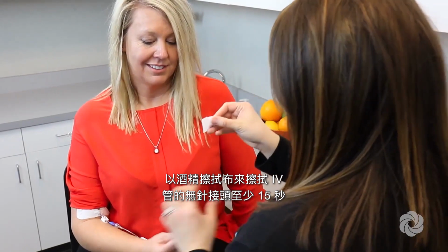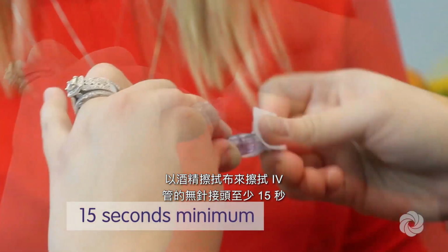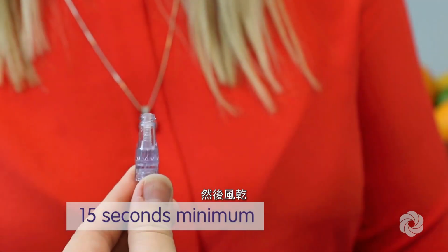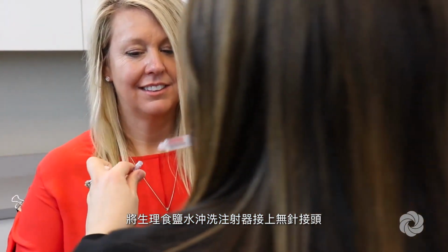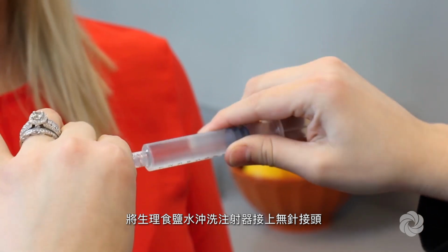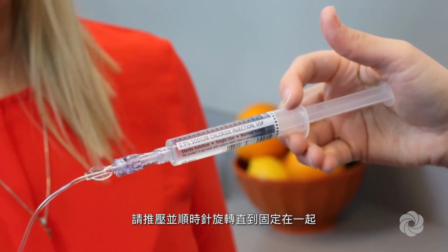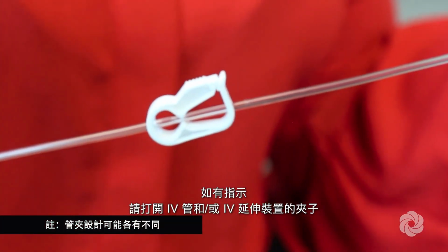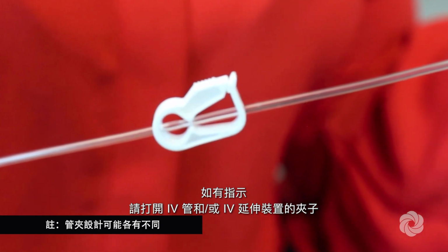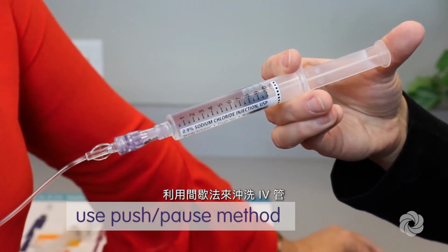Scrub the needleless connector on your IV catheter with an alcohol wipe for at least 15 seconds and allow to air dry. Remove the protective cap from the saline flush syringe. Attach the saline flush syringe to the needleless connector using a push and clockwise twisting motion until secured together. Open the clamp on your IV catheter and/or IV extension set if indicated. Flush your IV catheter using a push-pause method.